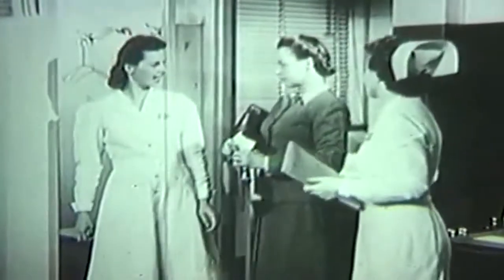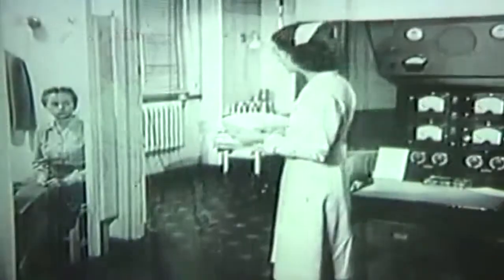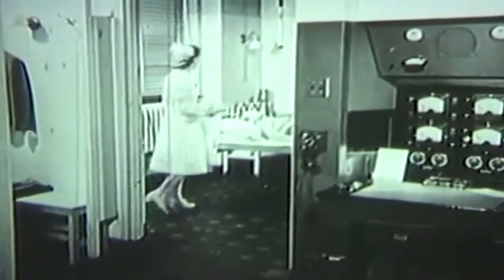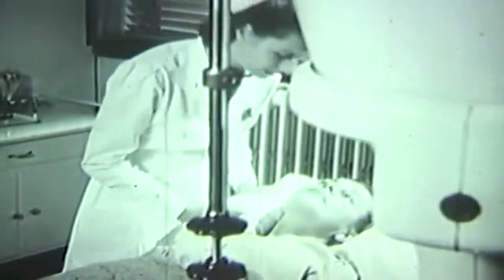When the treatment is to start, Mrs. Gordon's nurse introduces her to the nurse technician, who tells the patient how to prepare for the treatment. As Mrs. Gordon lies down, the technician again reassures her about her first treatment. The patient is made as comfortable as possible and instructed that she must not move during treatment. Sandbags provide firm support.